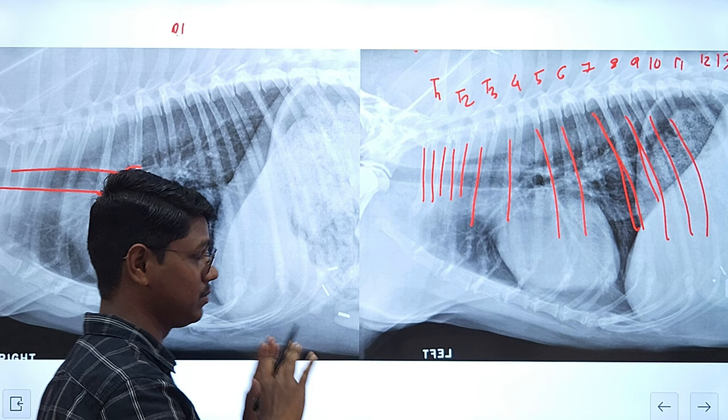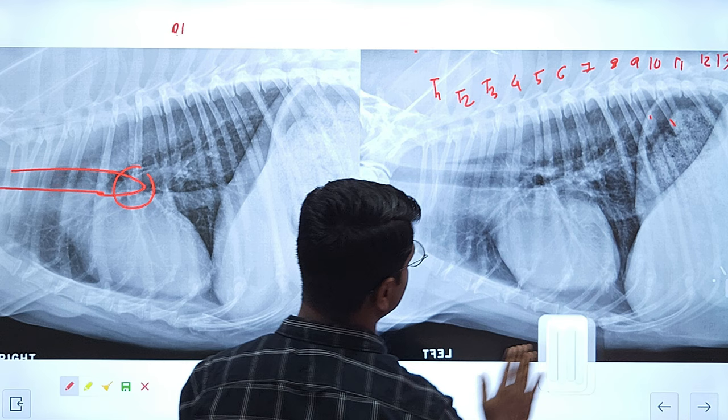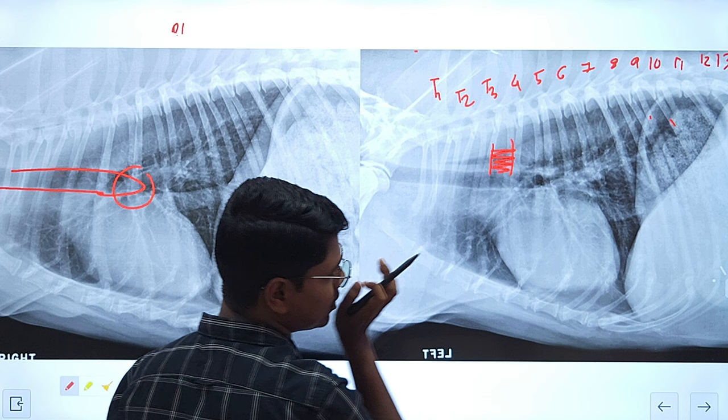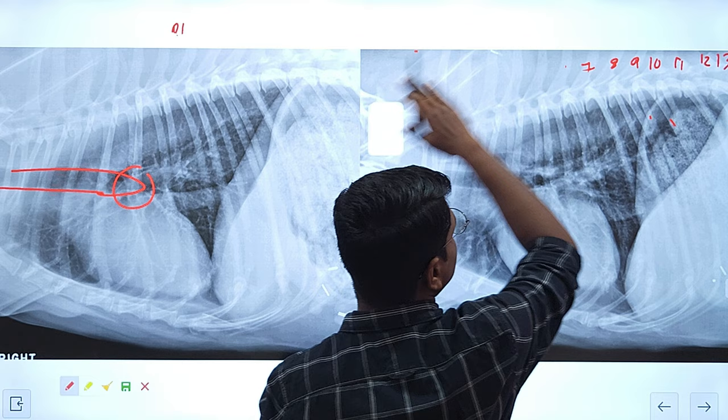Between the ribs are extra-thoracic structures — basically muscles, skin, and subcutaneous fascia. This is the thoracic wall for you.